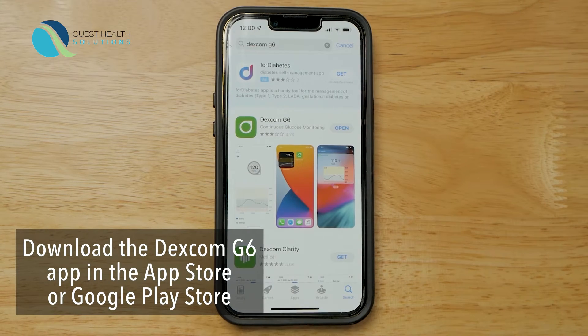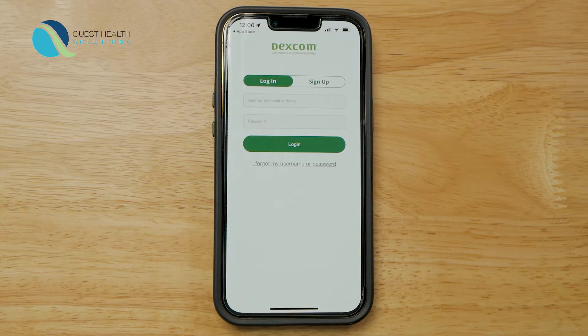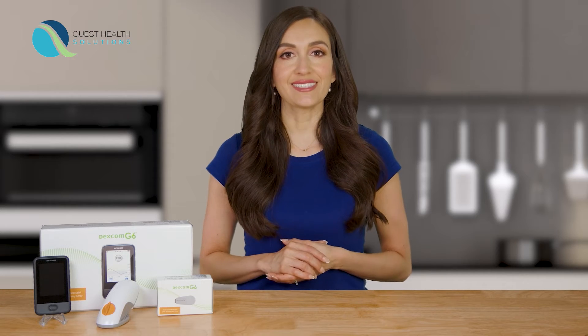Then go to the App Store or Google Play Store to search for and then download the Dexcom G6 app. Once the download is complete, tap the open button to launch the app. If you have created an account with Dexcom in the past, use that same username and password. If you have never created an account with Dexcom, go ahead and create an account. The app walks you through the entire setup process step by step.